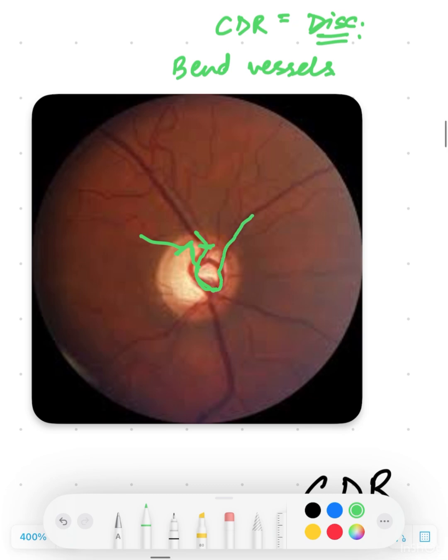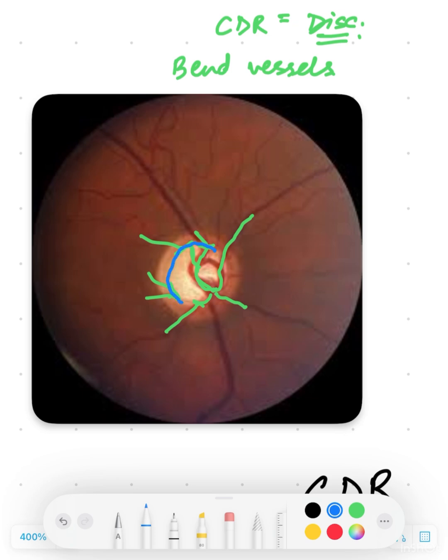The vessel here is pretty much straight, this vessel here has a bend, and these vessels are just coming out from this area. So we are assuming there is cupping here — a depression. When we join all these points of bends in the vessels, we come up with the actual cup of this disc. The blue circle I have drawn is the actual cup.